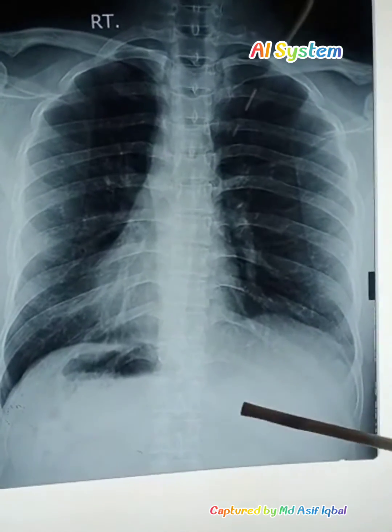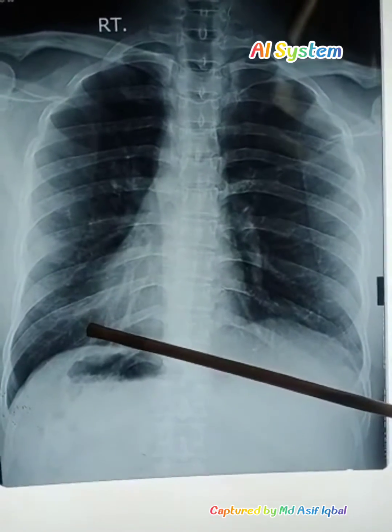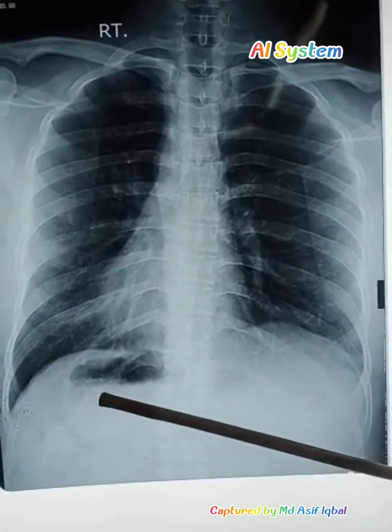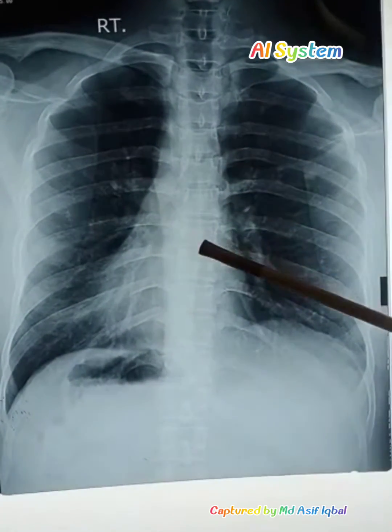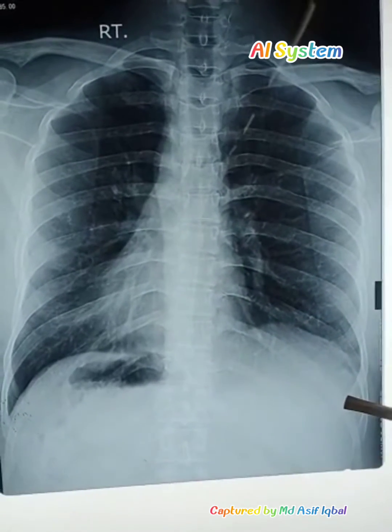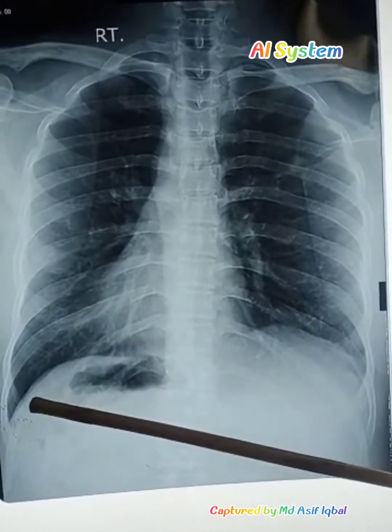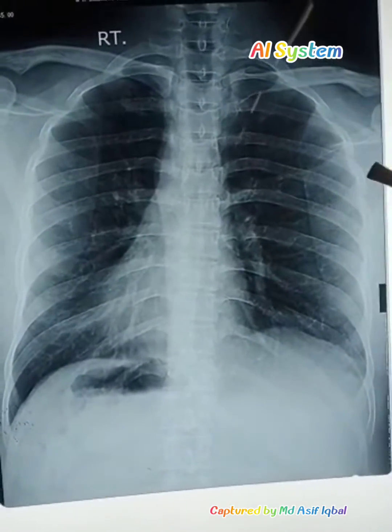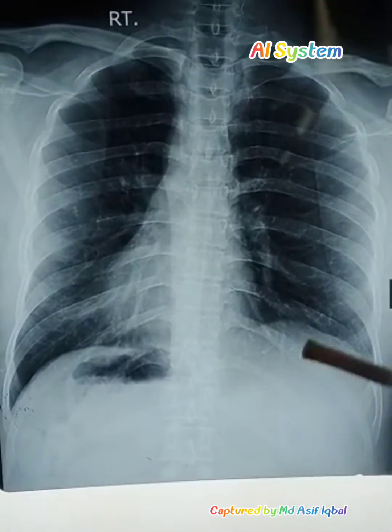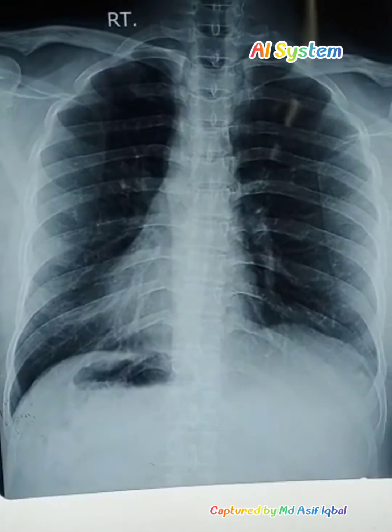This is not a normal X-ray because the patient has the apex of the heart situated on the right side, and the fundus of the stomach is also situated on the right side. Normally the apex of the heart is directed to the left side and the stomach is situated on the left side. In this case, both are on the right side — this means the patient has situs inversus, a mirror image condition where all structures are reversed.